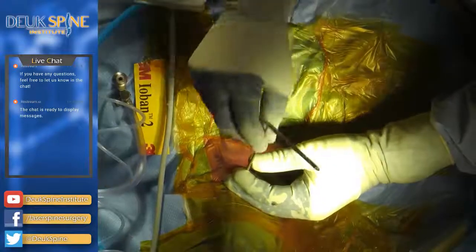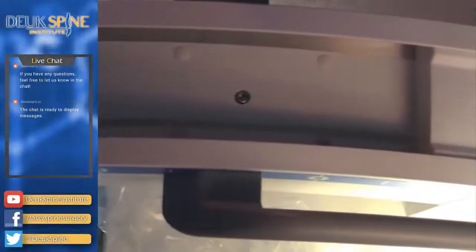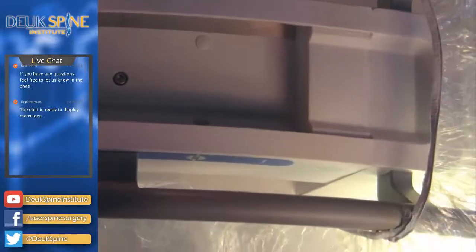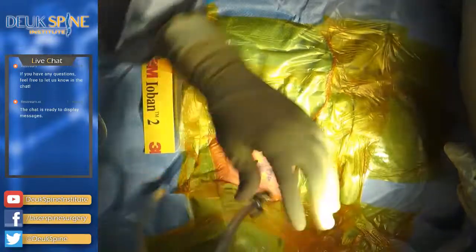So you can see the tube is now at the back of the disc at C5-6. The back of the disc is where the herniation starts. So the tube is literally right at the base of the herniation. And I'm going to start removing this herniation from the base, okay? Without taking the rest of the disc out. See that? That's pretty cool, huh? All right. Now, let's get this herniation out, and we'll be done with his surgery. Much better than that big open fusion we just did.